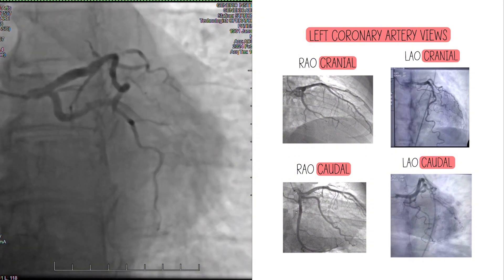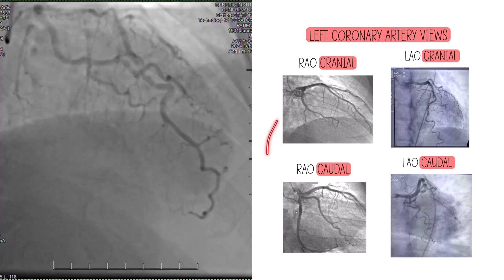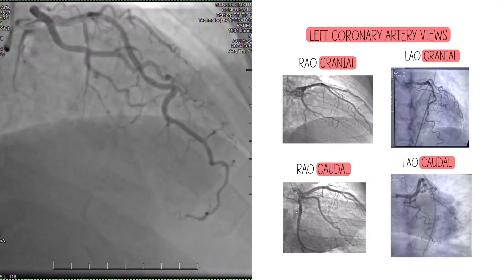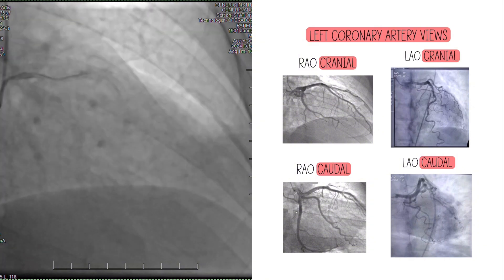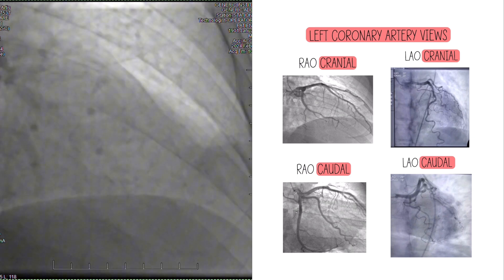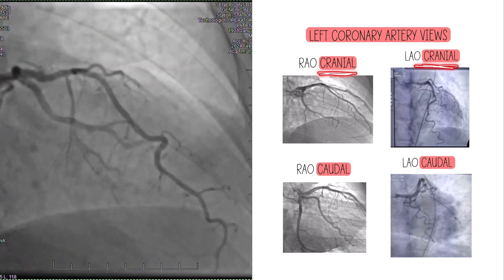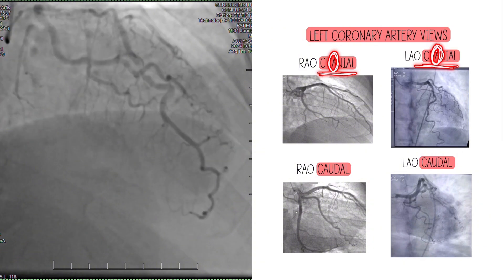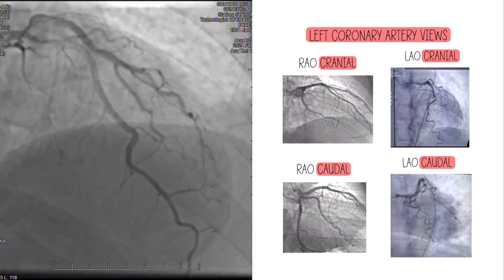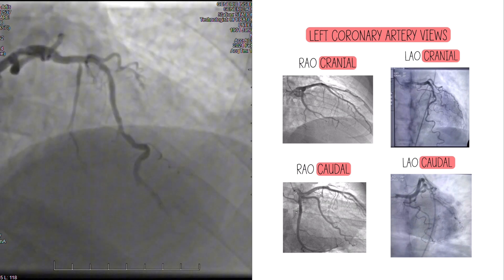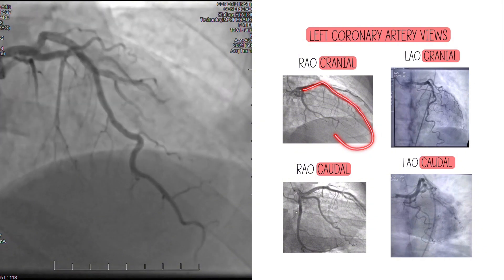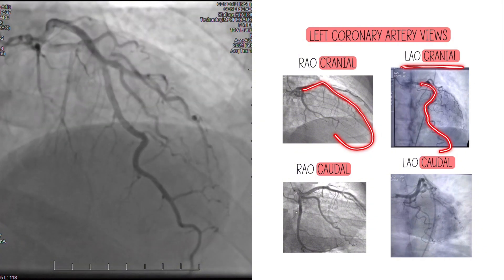So what are each of these good for? I've put an example angiogram — this is the same patient for all of the views. Let's start with RAO cranial. In the cranial views, the LAD is best shown. Now you're going to see the LAD and the circ in all the views, but what we're talking about is what do I see best, what is laid out best. So RAO cranial — here's the LAD. LAO cranial — here's the LAD.